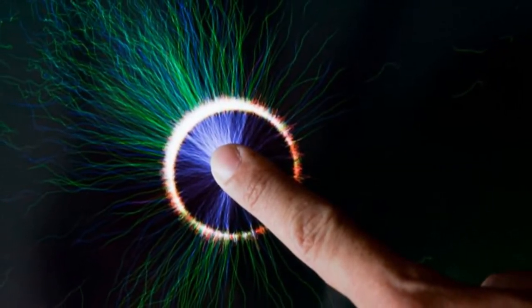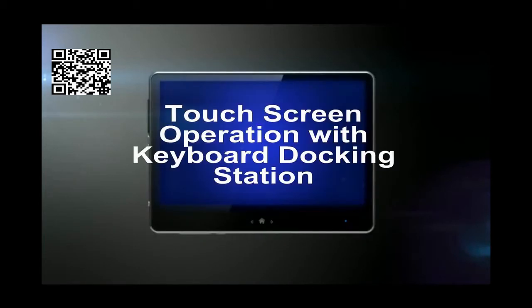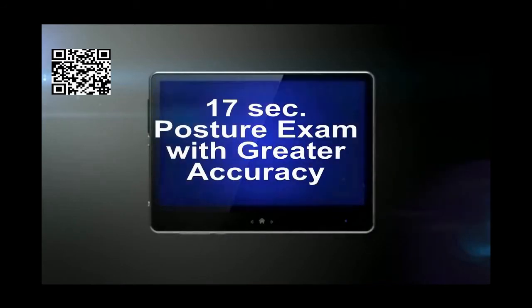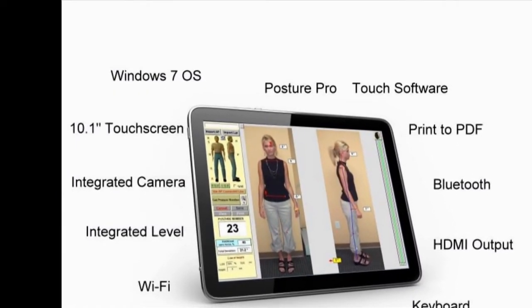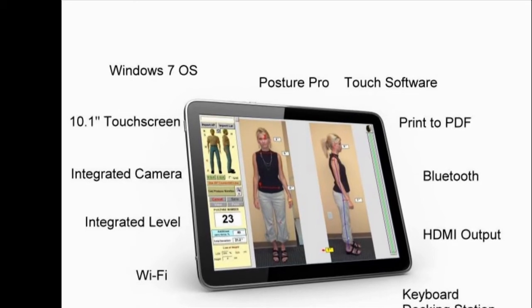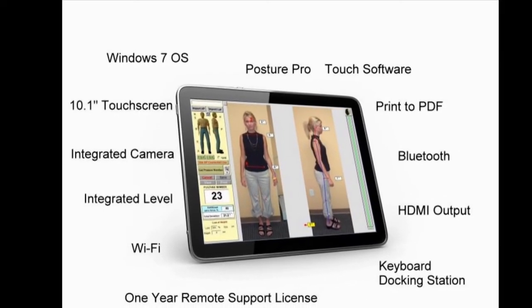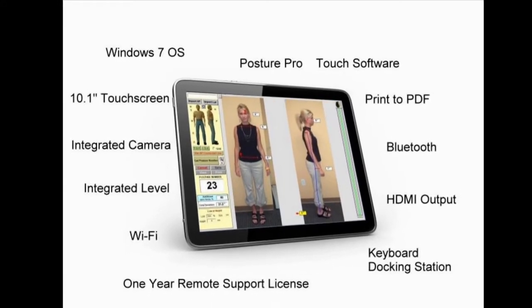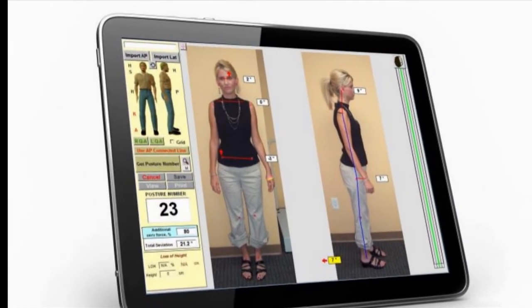The new Posture Pro Touch from Ventura Designs has it all: full touch screen operation, a Windows 7 operating system, built-in cameras and leveling system, Wi-Fi and Bluetooth, special analysis software, HDMI output, and even an integrated docking station with keyboard. Everything you need for fast and accurate posture exams in one small and powerful package. That's the Posture Pro Touch.